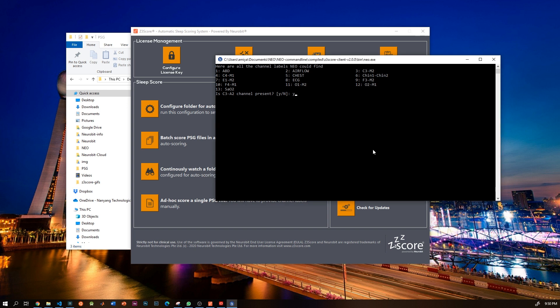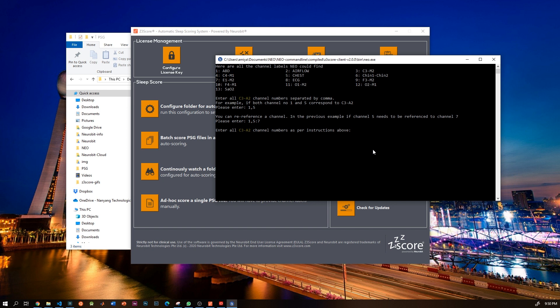Now you have to enter all the C3-A2 channel numbers, which for this particular case is just number three. Of course you can enter multiple channels separated by a comma. You can also re-reference a channel, for example you can re-reference channel 5 to channel 7 by writing 5 colon 7. But in this particular case it's just number three, so I enter number three.